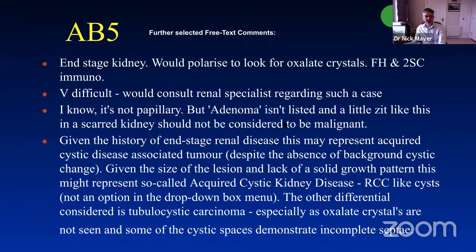Here's a nice one to make you smile. I know it's not papillary, but adenoma isn't listed, and a little zit like this in a scarred kidney should not be considered malignant. So maybe a little zit will make it into the next WHO classification.